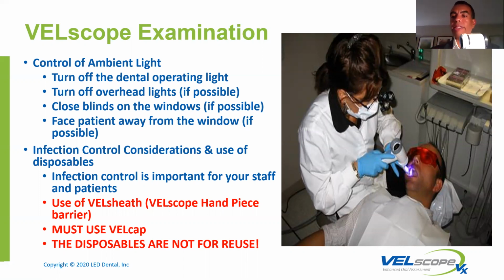So we can avoid that by, again, using a cap after every patient. If you find that there's any dust that collects in there, just wipe it down with a dry lint-free cloth. But again, no liquids either in the mirror edge or on the base where the charging portion goes in. If you feel like you have to wipe it down, squeeze out that towelette, if you will, that you're using, and then again, wipe the outside only.